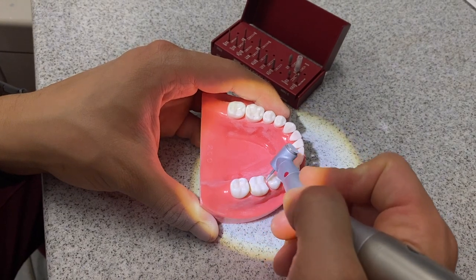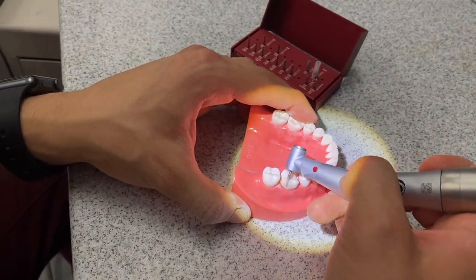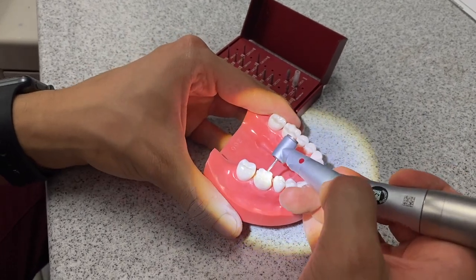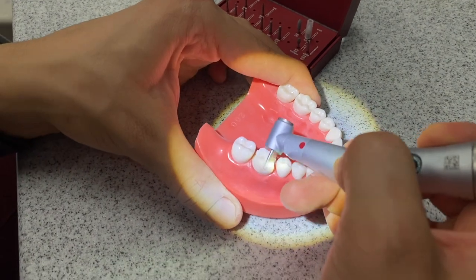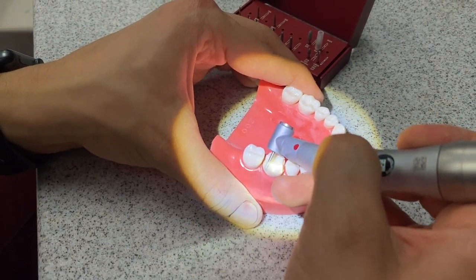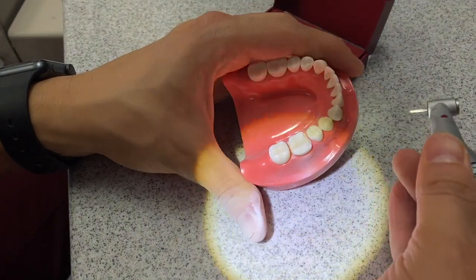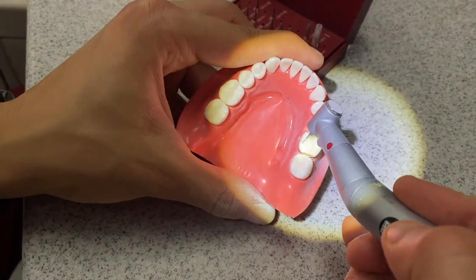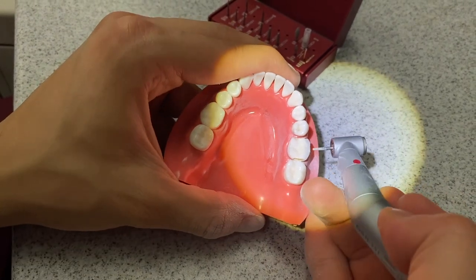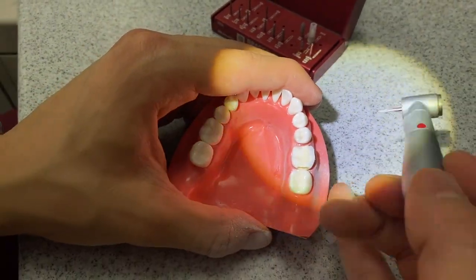At this point we already have the lingual and buccal reduction. Now I'm going to move on to the functional cusp bevel. Reminder: on mandibular teeth, you want that functional cusp bevel on the buccal side — that is the side that's occluding with the maxillary teeth. On maxillary teeth, it's going to be on the lingual. We're going to do some depth grooves and smooth them out. Looking at it from the occlusal, we can see the lingual, the buccal, and the functional cusp bevel are reduced. I'm going to go back in and smooth out any sharp areas along here to make sure there are no sharp areas on this crown prep.